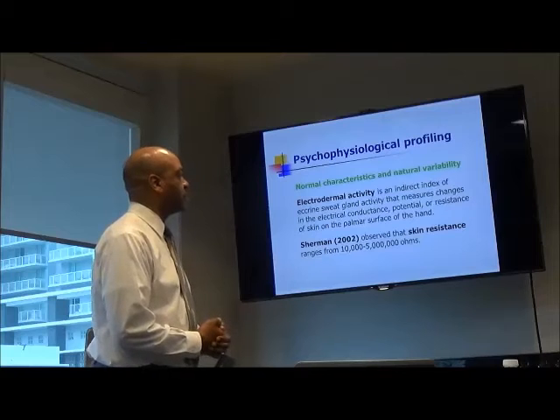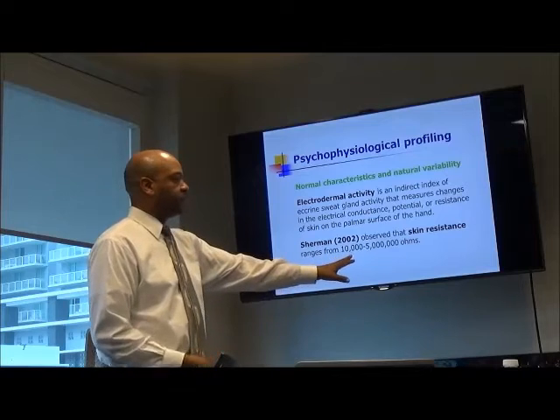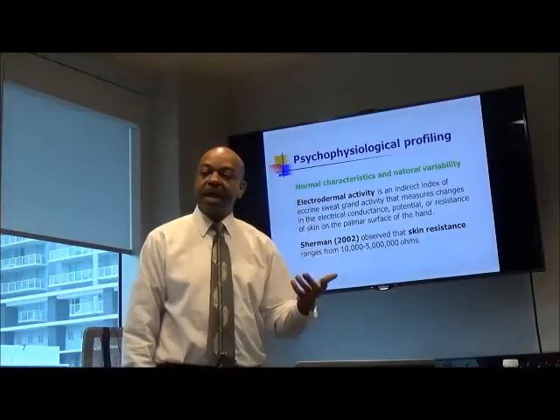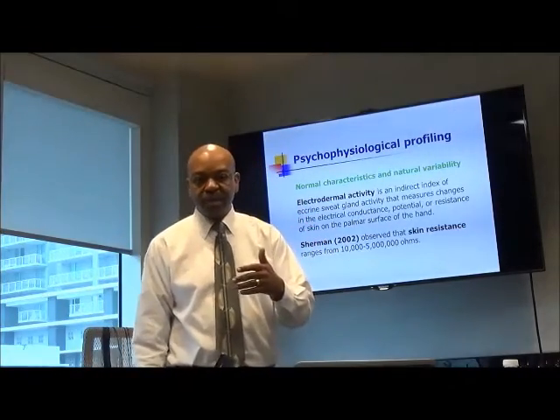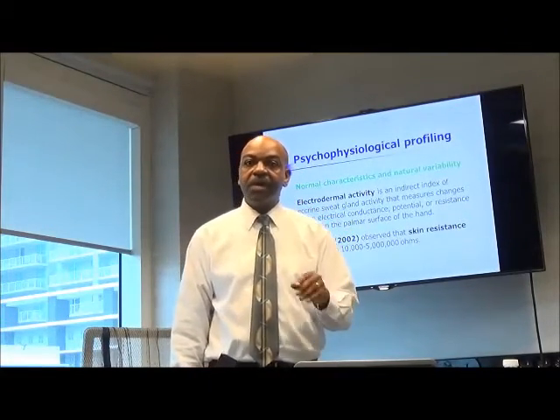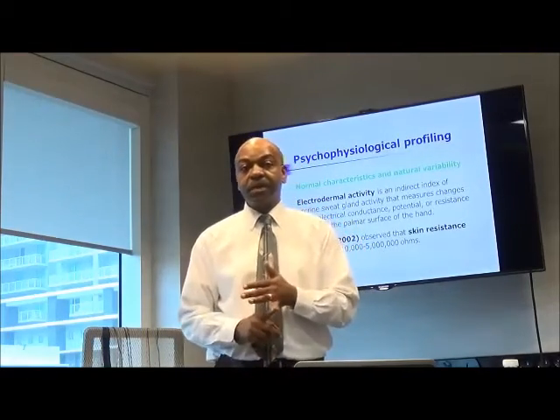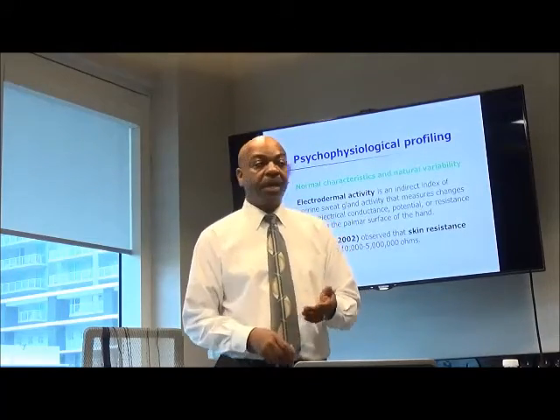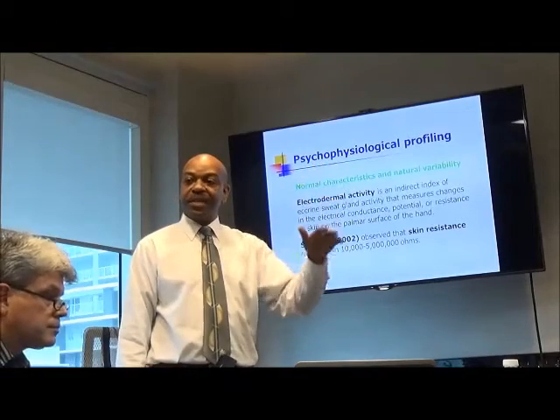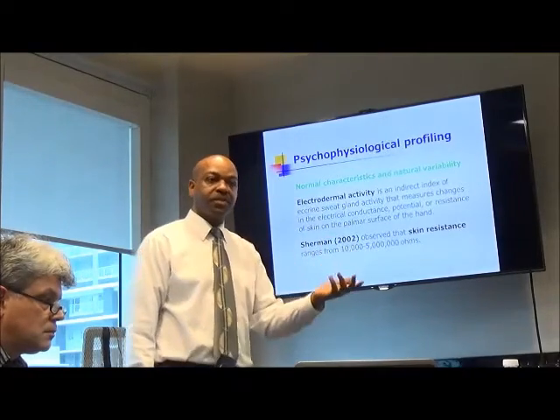Electrodermal activity, that's the sweat activity. It's showing figures for resistance, which is like the opposite of conductance. Most of the equipment, well, I know for Thought Technology equipment, is only going to show conductance readings. For the J&J, which we were also using yesterday, you have the choice of looking at conductance or resistance measures. So it's important to know that the direction of the change you're looking for is opposite when you're looking at resistance versus conductance.